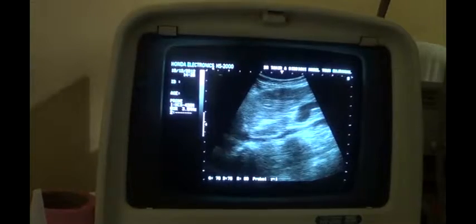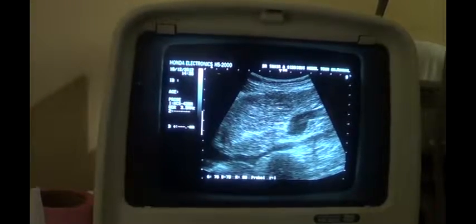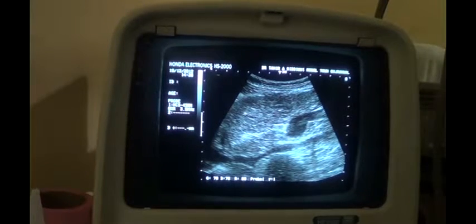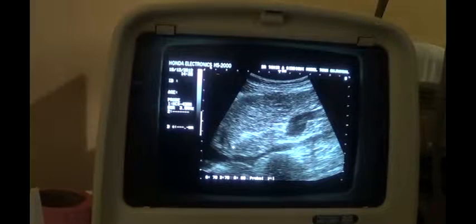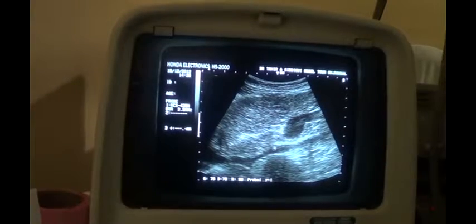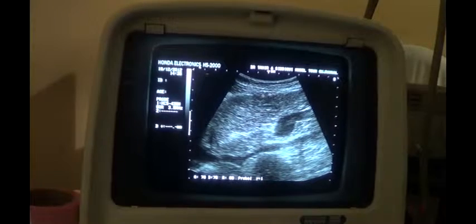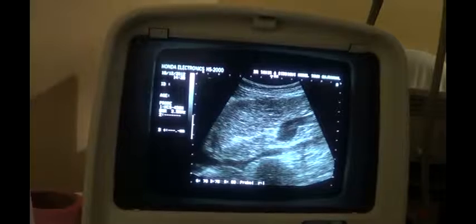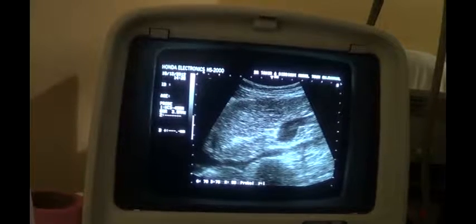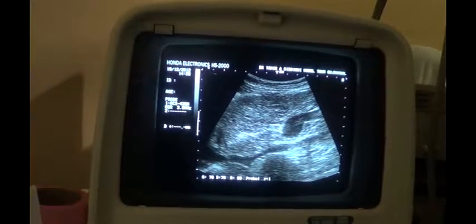And in this case, you will see the irregularity of the outer surface and the degree of coarseness. The point here to show you is that this is the ligamentum venosum, as this is the left lobe of the liver in longitudinal section. This is the ligamentum venosum, wavy shape. This is the caudate lobe of the liver. This is the inferior vena cava.